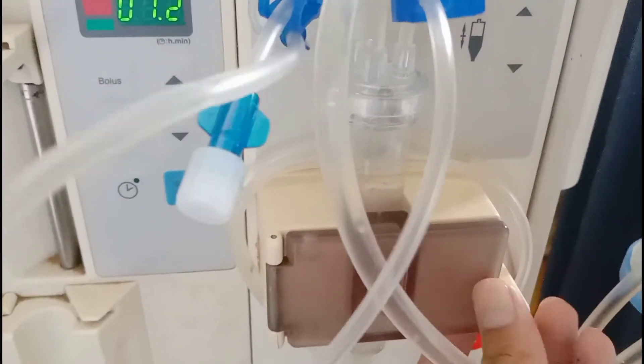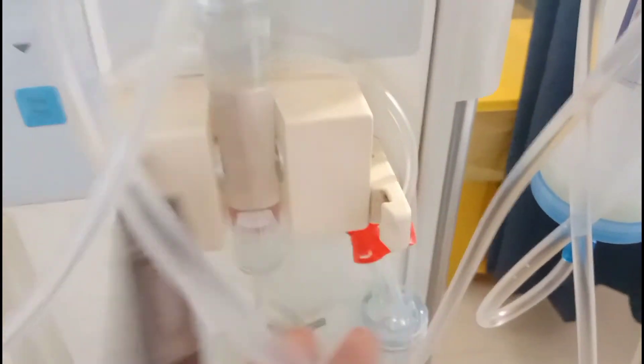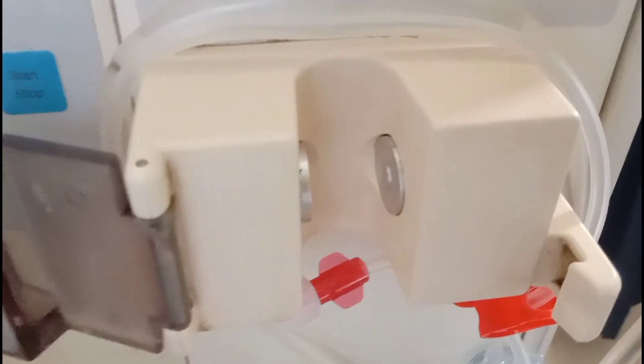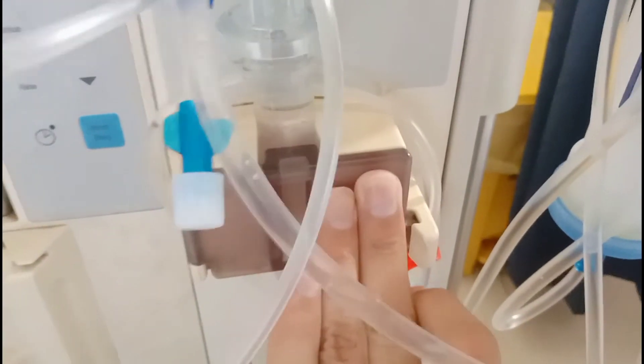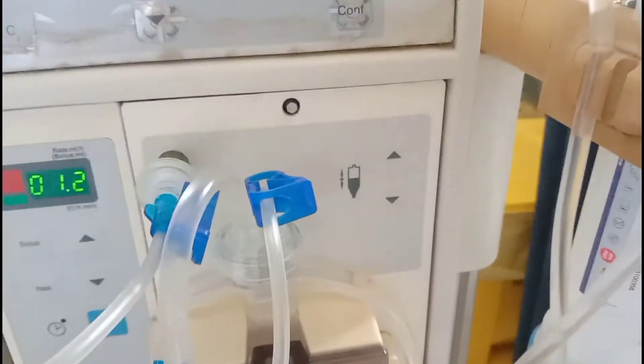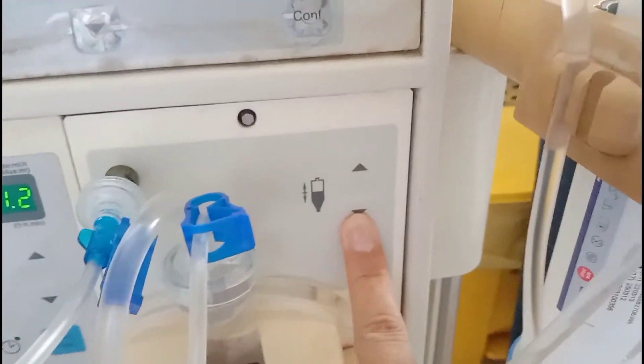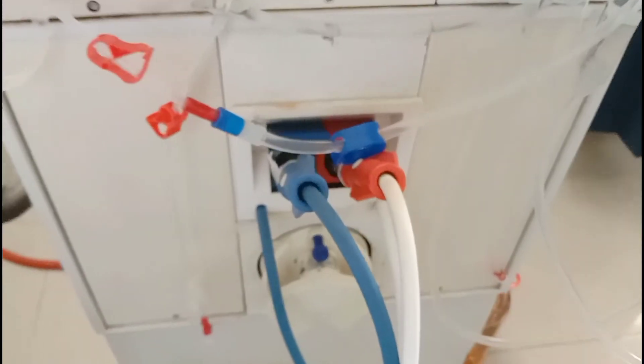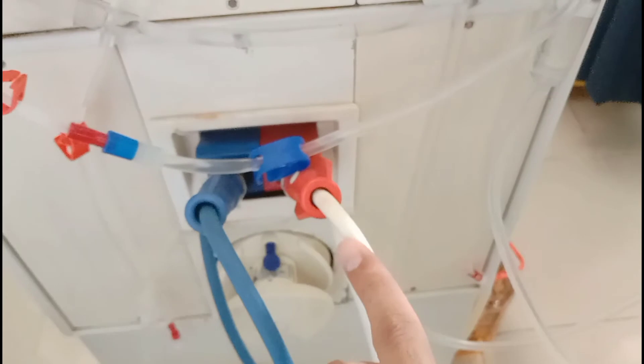This is the overall view of a Fresenius hemodialysis machine. This is the venous occlusion chamber holder — you can call it the venous chamber holder. Here is the level detector from where the level of the blood is detected. If the level is below, the machine will automatically turn off. From here you can increase or decrease the level of blood in the venous chamber.